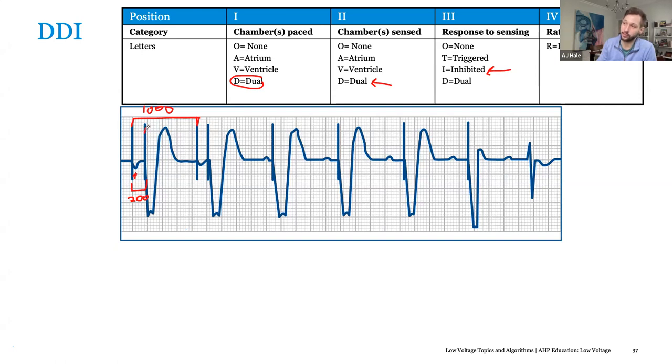So our ventricular paced event occurs, and it has then subtracted 200 milliseconds from what your ventricular based timing was, which is 1000 milliseconds. It subtracts 200. I'm left-handed and I'm using my right hand, so if this looks terrible, that's why. So your actual A to A timing is based on your V to A timing of 800 milliseconds after the ventricular event occurs.